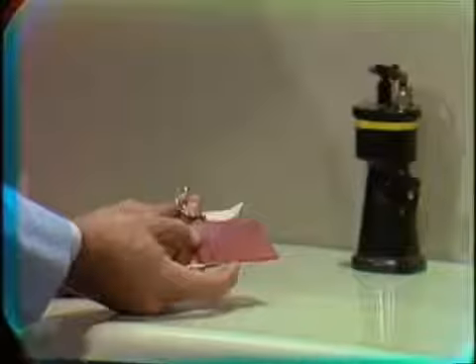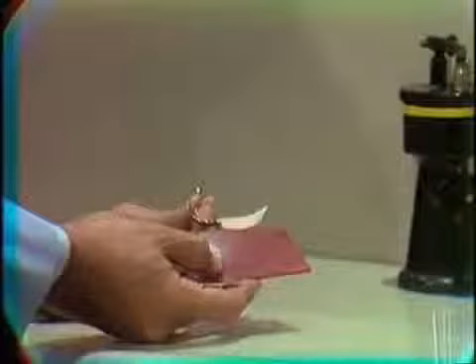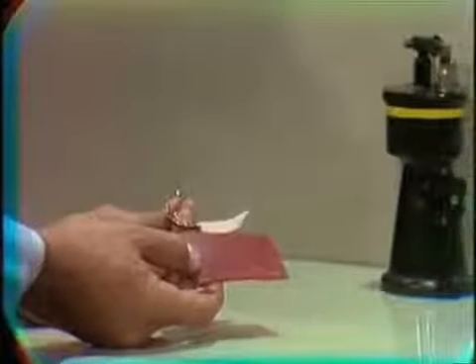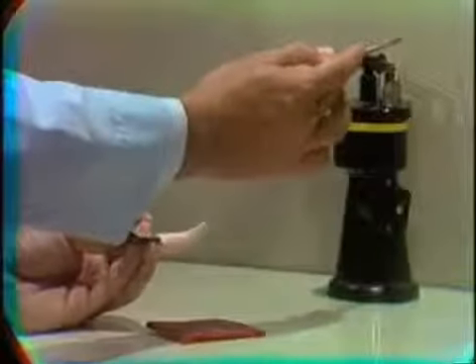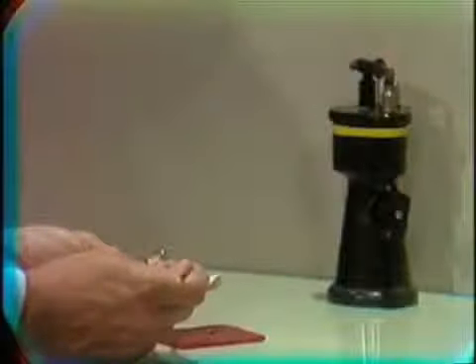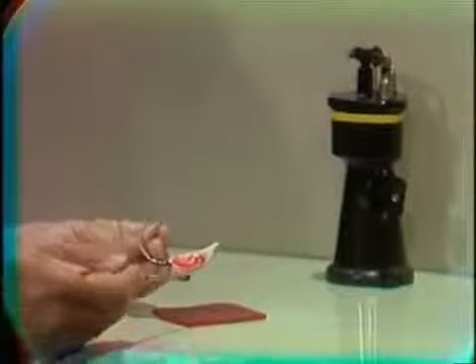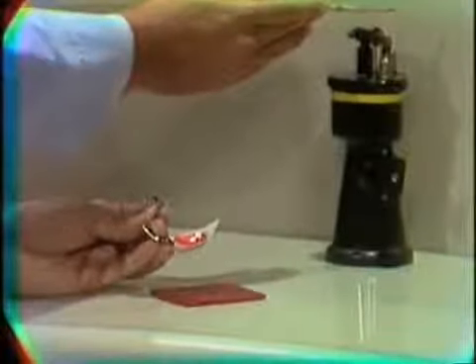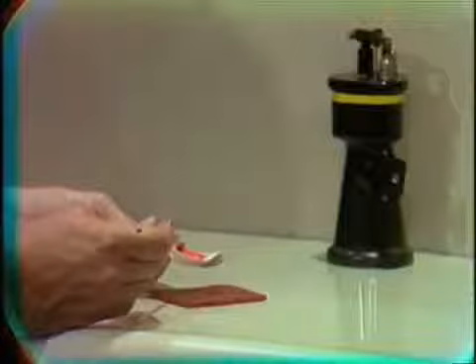This is called Bosworth synthetic tacky wax, and it is made purposely for functionally generated path procedures. Now we'll add this wax in small increments to this occlusal surface. That will allow us, when we are finished, to have the wax softened probably all the way through.